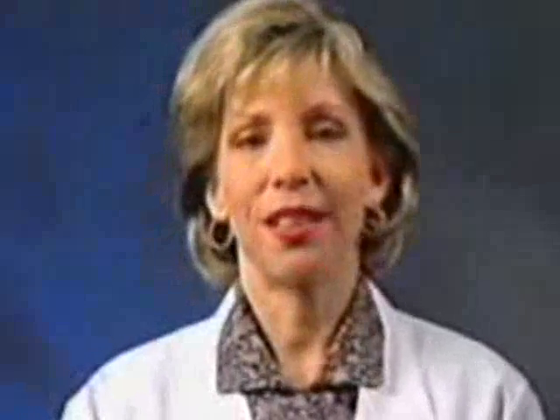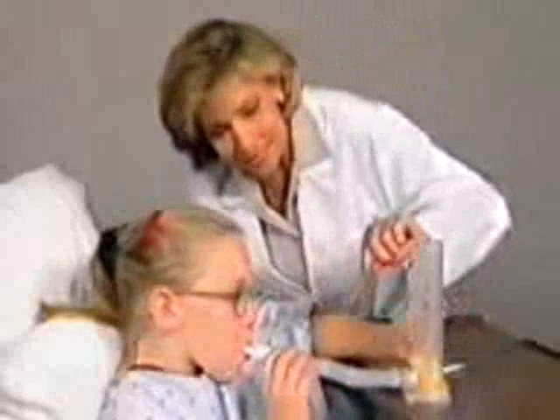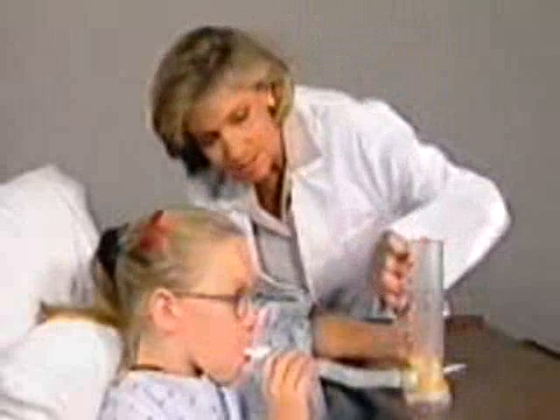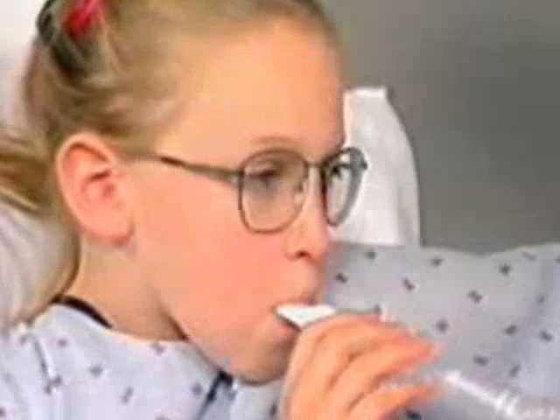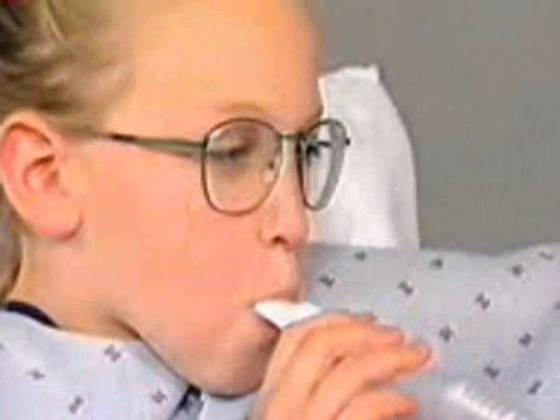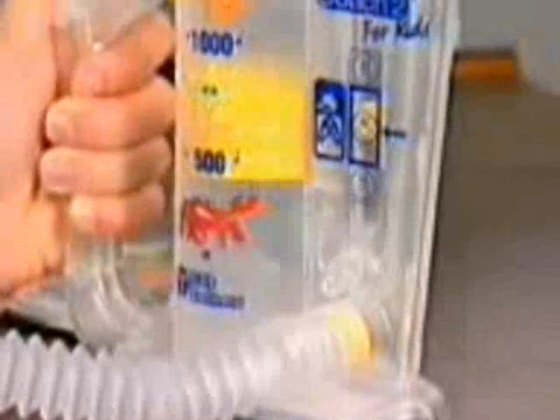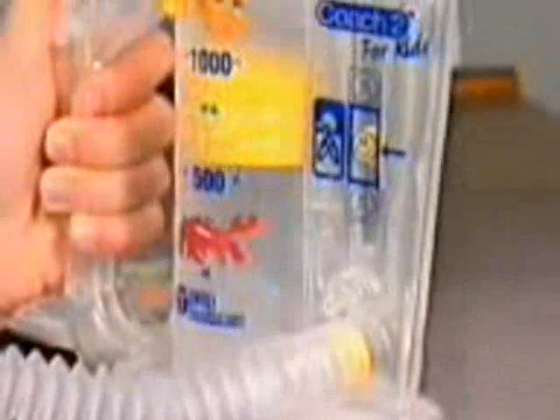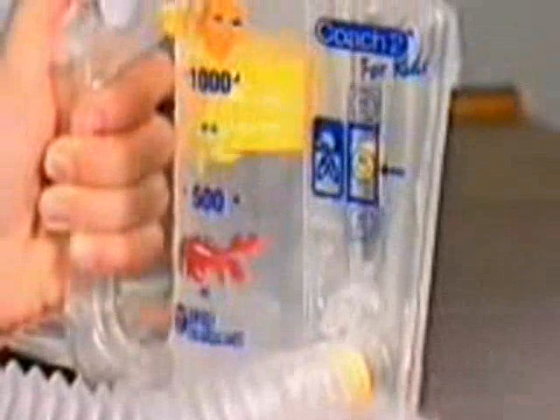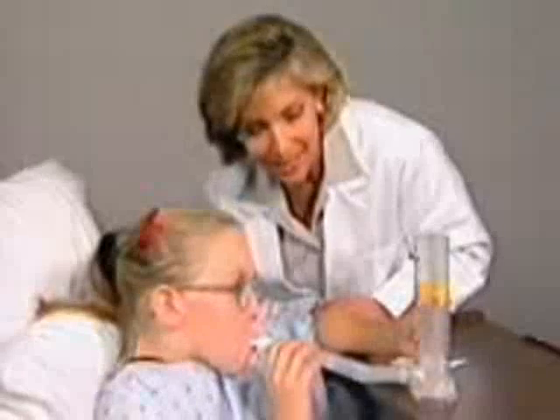Now, let's do one or two breaths with the COACH II. Use your left hand on the handle of the COACH II, adjust the tubing, and place the mouthpiece in your mouth and seal your lips around it. Exhale normally through your nose. Slowly begin to inhale through the mouthpiece, keeping the yellow inspiratory coach as close to the happy face as possible. Breathe in as deeply as you can, noting how high the top of the large yellow piston rises.